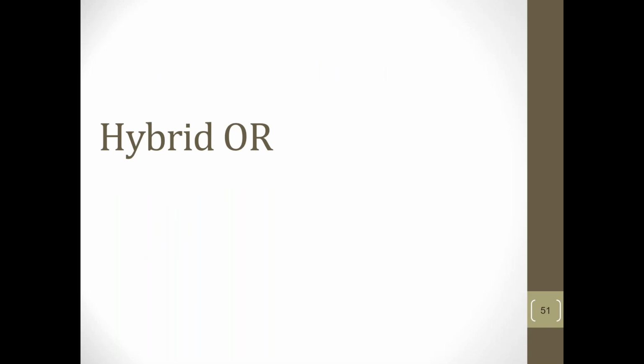Okay, so hybrid OR, and here's one of those terms that's used rather generally. Basically, it's a vascular cath lab type system in the OR, if you want to break it down. There's all different names for it. It's kind of crazy because, even in the same health system, they call them different names. But basically, it's a cath lab system that's in the OR.